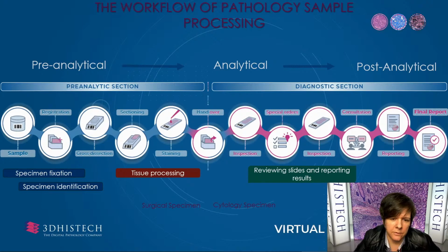Clinical pathology is now an essential component of high-quality clinical care. Pathology tests are important for reaching diagnosis in 85% of hospital patients. Indeed, in some areas, including oncology, infection, and transplantation, a final medical diagnosis and optimal treatment cannot be delivered without histopathology investigation. Despite the importance of routine pathology, the workflow is the most complex diagnostic procedure. The daily work of a pathology lab can be divided into 3 different phases: pre-analytical, analytical, and post-analytical.